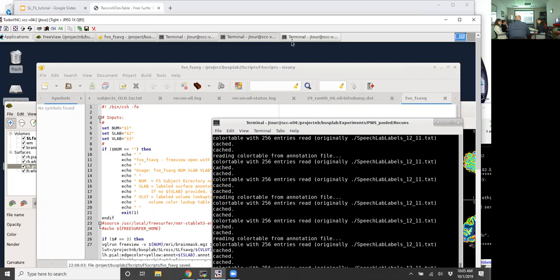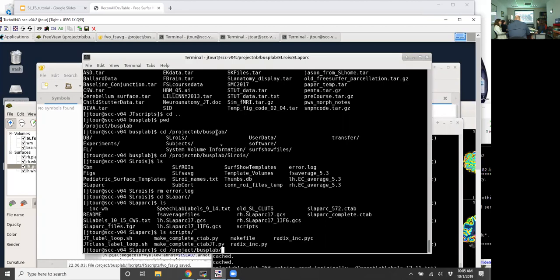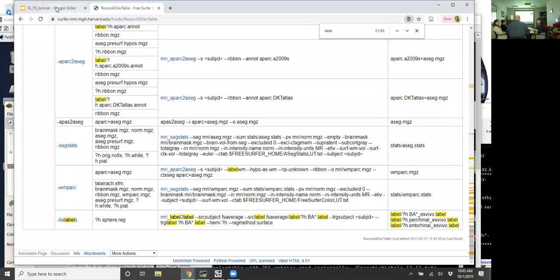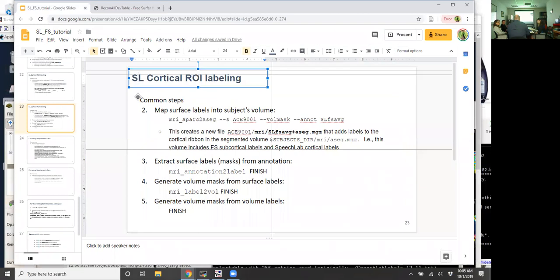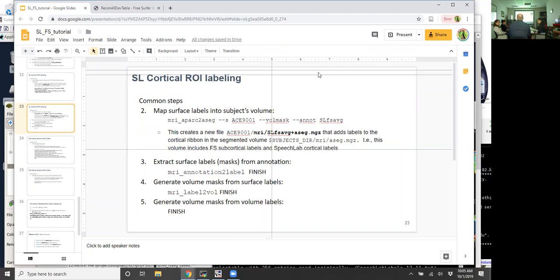Okay, so if we were working with structural data in the future, if you're going to do structural data analysis, you would want to learn that, and I do think it's worth us going through that, or finding someone that has looked at a lot of these.